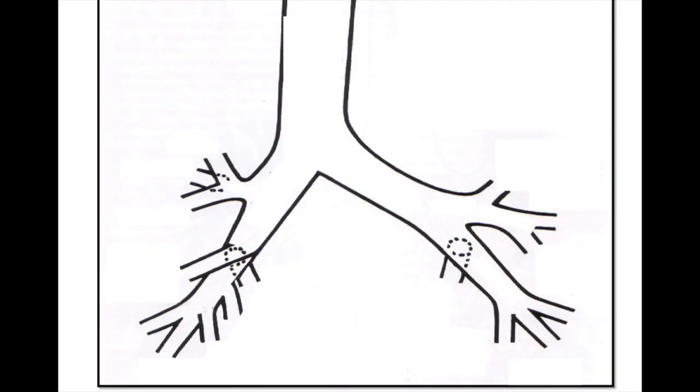This diagram summarizes the process of obtaining cryobiopsy. After confirming location of the target, an endobronchial balloon is placed proximal to the target segment to tamponade bleeding. The cryoprobe is then advanced through the working channel of the bronchoscope. After freezing a few seconds, the cryoprobe is then withdrawn along with the bronchoscope while the balloon is inflated to tamponade any significant bleeding.